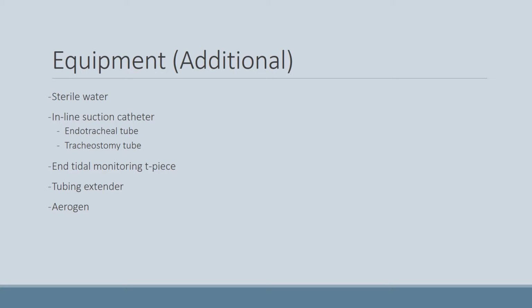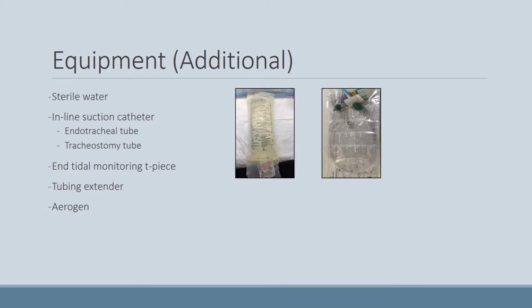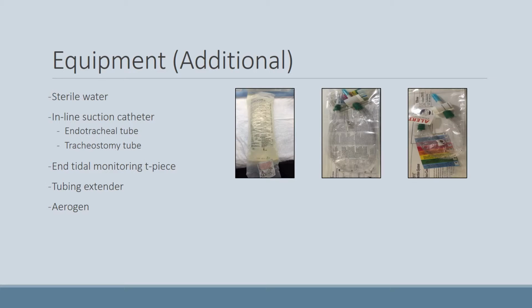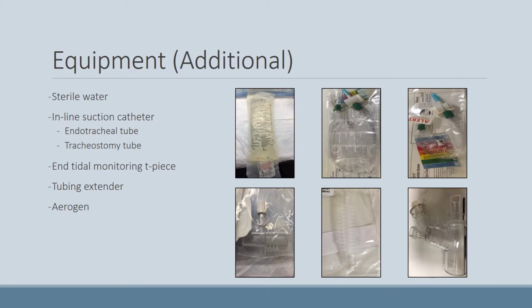Most commonly with Fisher & Paykel setups with this humidifier, you'll see sterile water. You'll see sometimes inline suction catheters with endotracheal tubes or tracheostomy tubes, most commonly in different sizes and lengths depending on the type of tube and patient population. Some facilities use end tidal monitoring, seen with a heated wire circuit with a T-piece in line. This is a piece of tubing extender which can be added and is very useful if you have a trach tube or any difficult airway, if you need a little slack or anything pliable that hooks up to the end of the heated wire circuit. And if any patient has respiratory treatments, an Aerogen is commonly placed for that use.